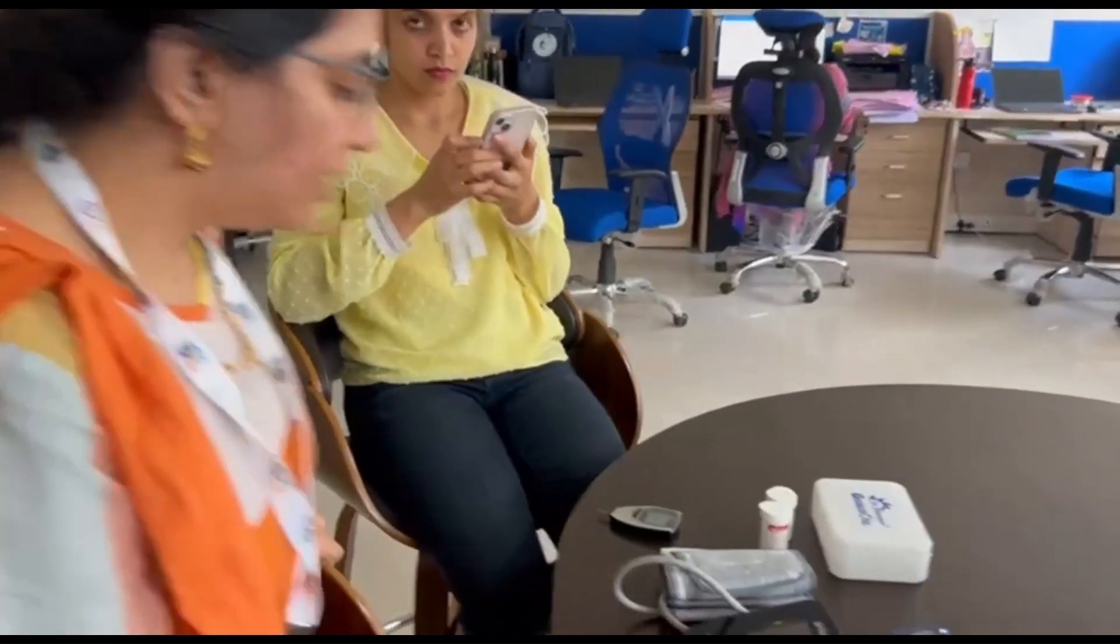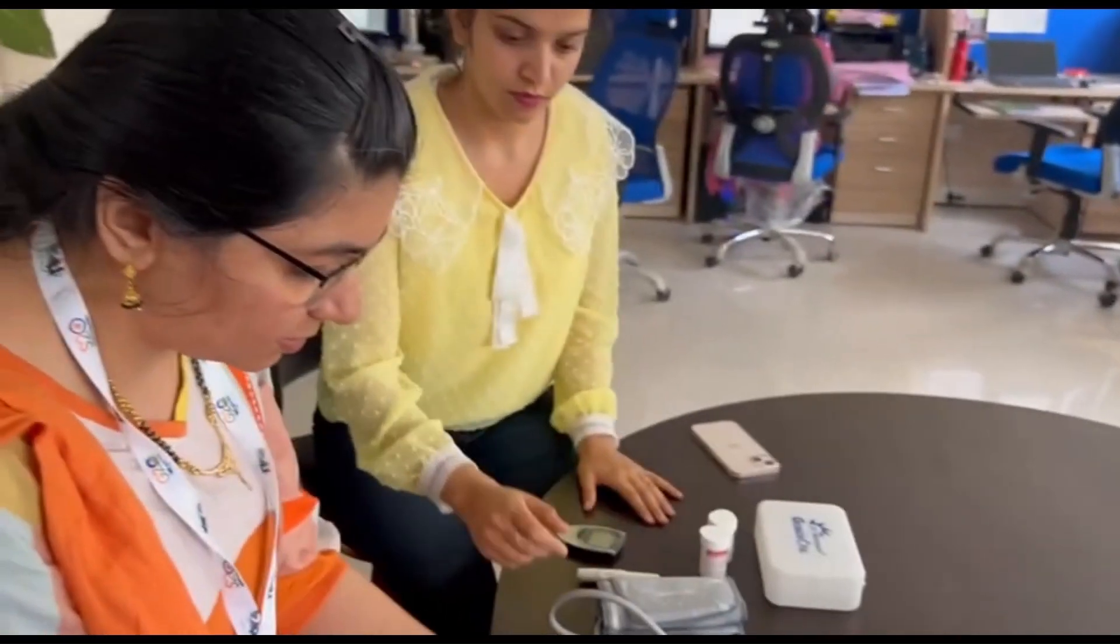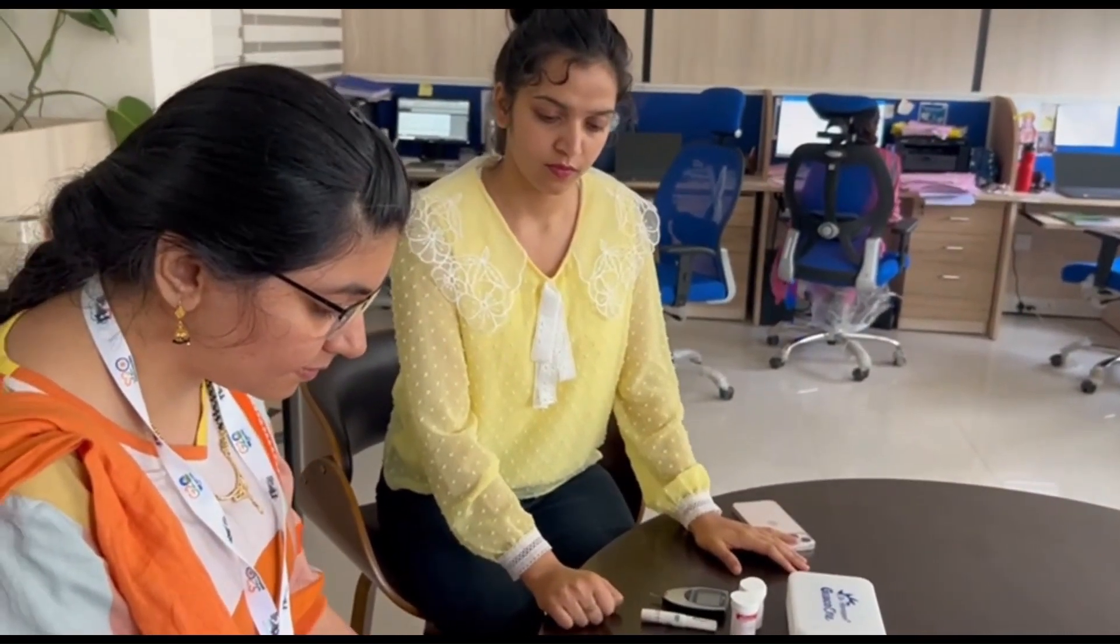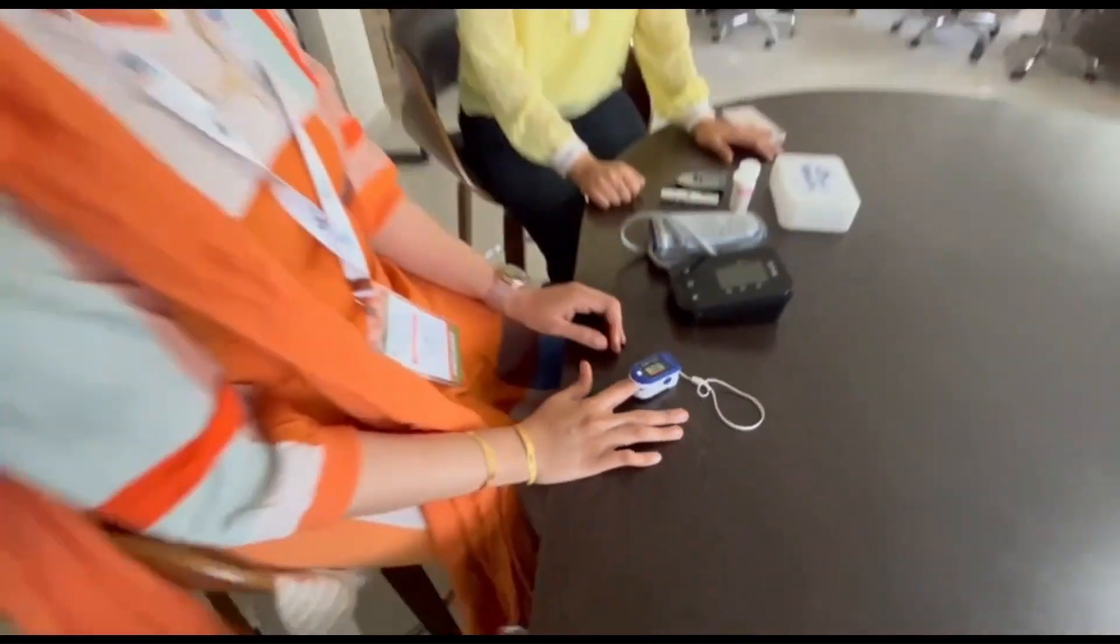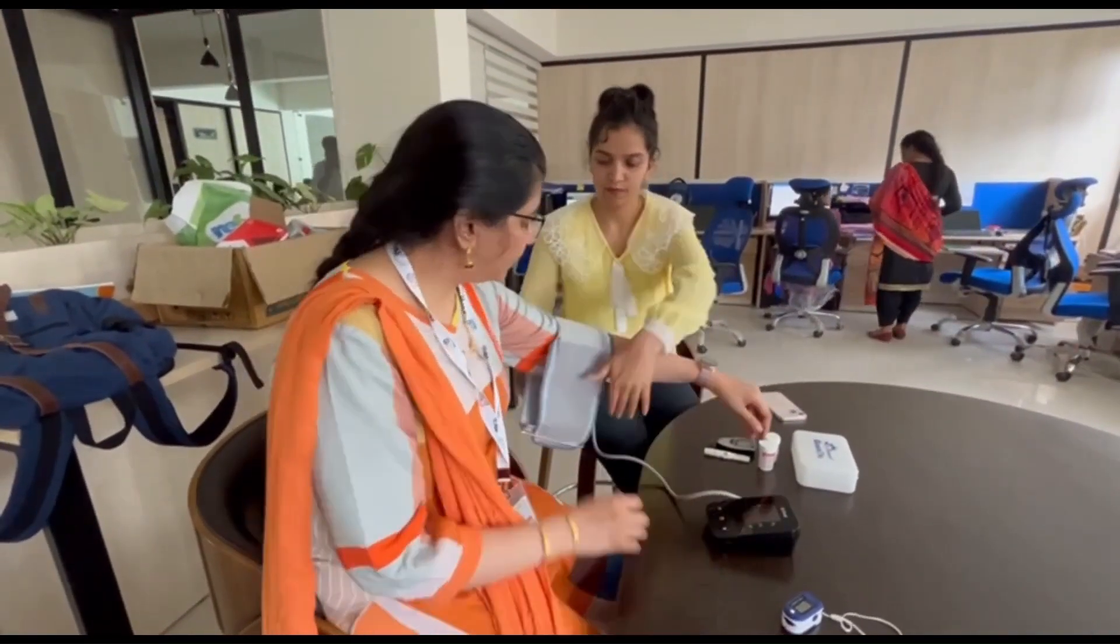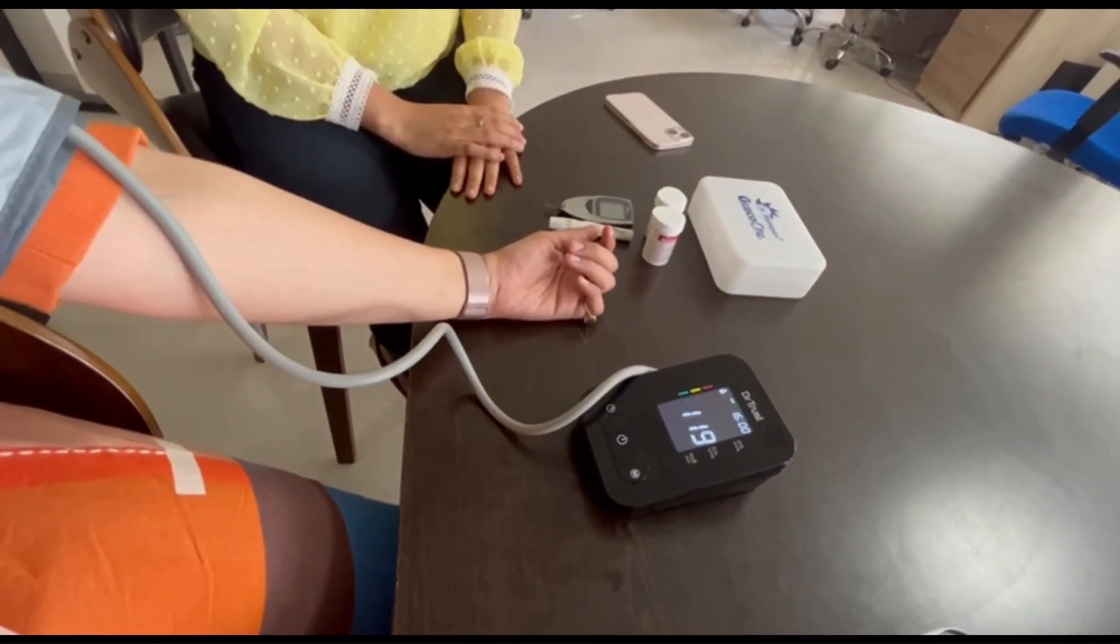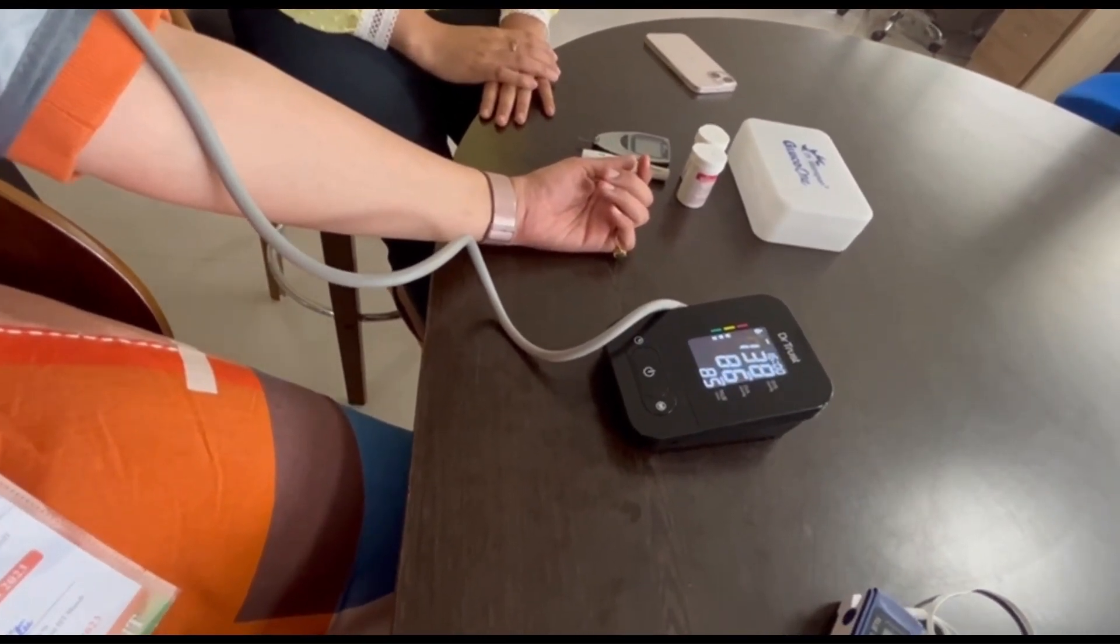We have obtained the sensor's response to the breath sample but we also need to capture the body vitals details. We'll be using the standard digital healthcare devices for measuring the body vitals such as SpO2, which is the oxygen supply in the blood, heart rate and blood pressure. The pulse oximeter shows the heart rate as 87 and SpO2 as 98. Next, we'll be checking the blood pressure and we have the blood pressure reading as 138 over 86.